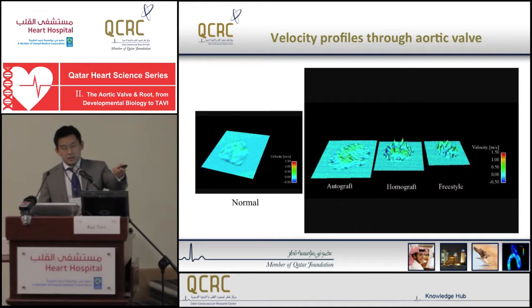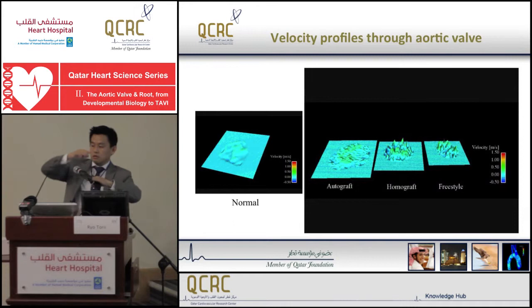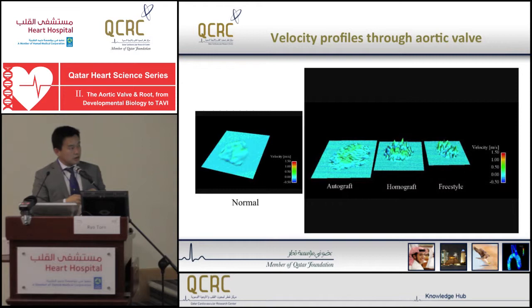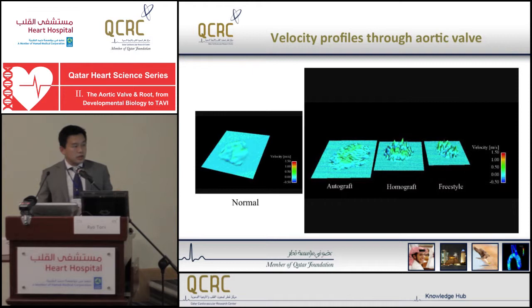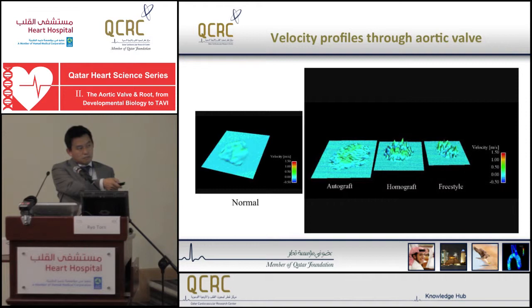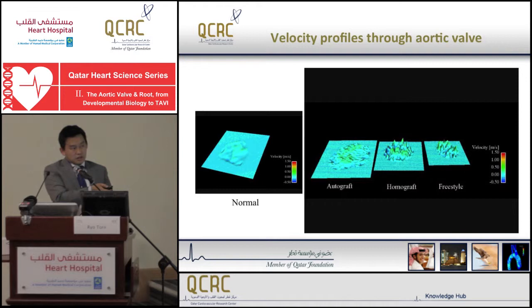These movies show representative flow patterns of normal and three patient groups. The normal case shows flow coming through the valve with a very flat top and triangular shape, corresponding to the orifice area of a tri-leaflet valve. Looking at post-operative flow patterns, we can see quite a difference. The autograft maintains a triangular shape with a very flat top, whereas the homograft and freestyle bioprosthesis show a sharper distribution of velocity with higher values in the middle.